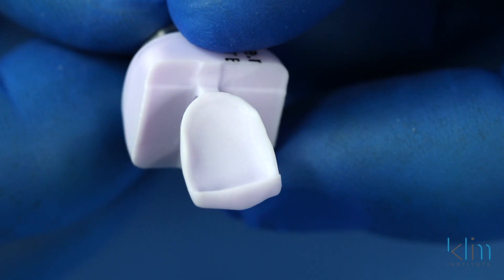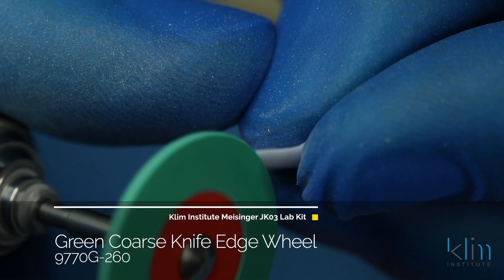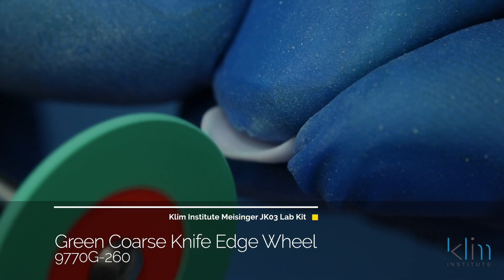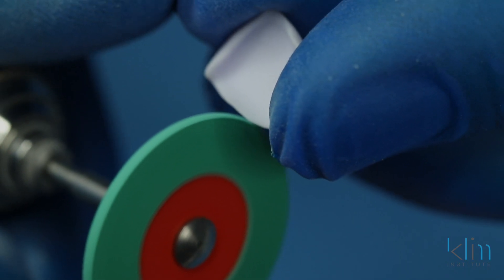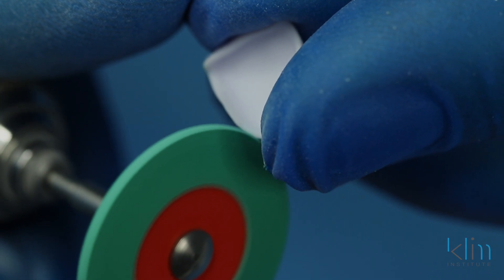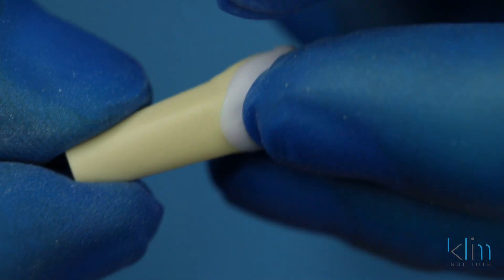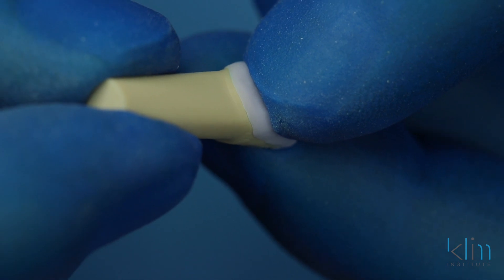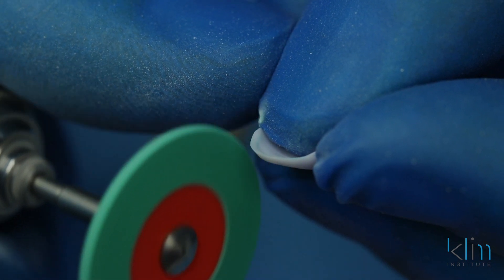Our next step is to thin the margin. During the mill, we used a margin parameter to bulk that margin so it doesn't chip. You can see it was very smooth using the EF Burst system. I like the green coarse knife edge wheel for our first stage of thinning the margin. We're not going to thin it too thin, though, or you'll get microchips on the margin. Our final thinning will happen after crystallization. This is where I prefer loops — I have loops and a magnifier, loops times two and a half, so I'm experiencing 13 to 14 times visual acuity on those margins.